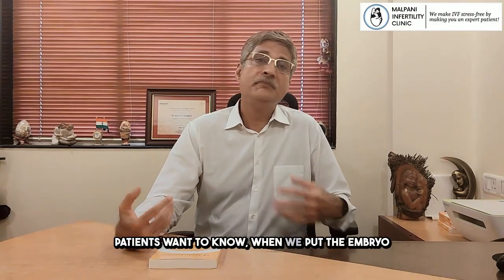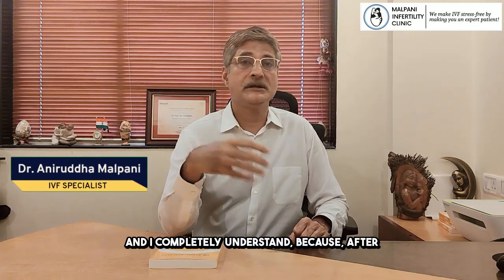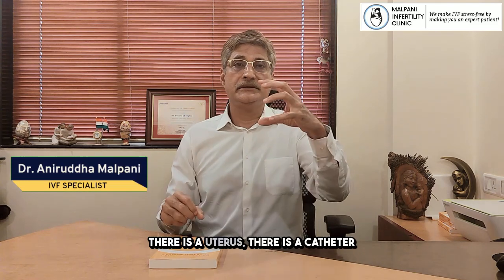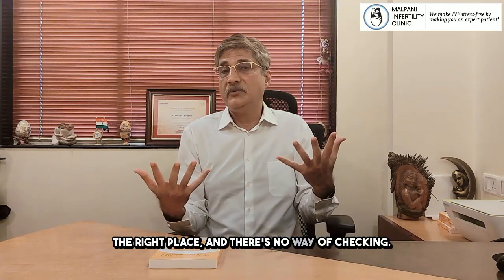Patients want to know, when we put the embryo back in the uterus, how can we be sure we're putting it in the right position? And I completely understand, because after all, it's a blind procedure. What does a blind procedure mean? There is a uterus, there is a catheter in which the embryologist puts the embryo, we put it inside and we hope it's in the right place. And there's no way of checking.